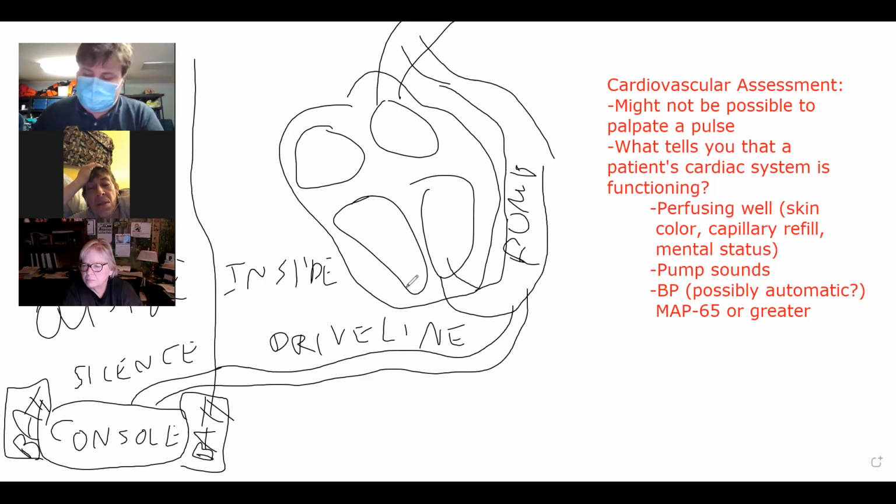And if, in consultation with your VAD coordinator and your medical controller, or if you're unable to reach either of them, in your best clinical judgment you found that you can't get the pump working and the patient's still in full cardiac arrest, you are going to be starting CPR. That's pretty much the answer. So it's what have you done to try to fix the problem, and are you at the end of your possibilities for trying to solve it?